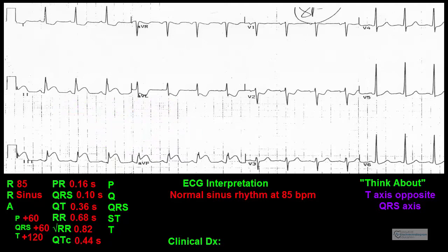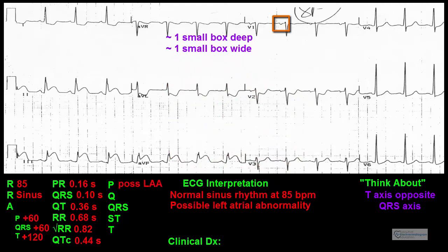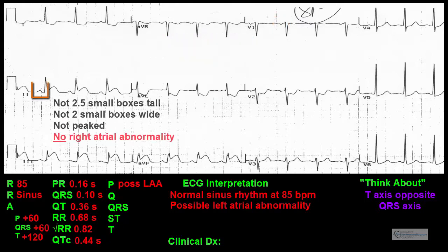Now for the wave morphologies. P waves: P waves in lead V1 are about one small box deep and one small box wide, suggesting possible left atrial abnormality. Possible left atrial abnormality can now be put into the ECG diagnosis section. The P waves in lead 2 are not 2.5 small boxes tall, 2 small boxes wide, nor peaked — therefore, right atrial abnormality is not present.